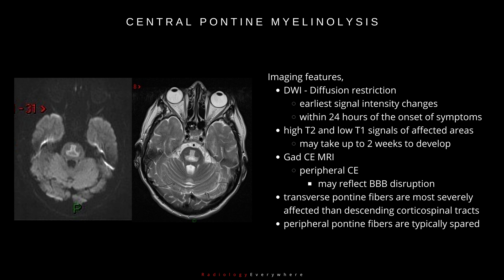When considering imaging features, diffusion-weighted images show the earliest signal intensity changes as restricted diffusion within 24 hours of the onset of symptoms. This region subsequently demonstrates high T2 and low T1 signals, and the T1 and T2 changes may take up to two weeks to develop.